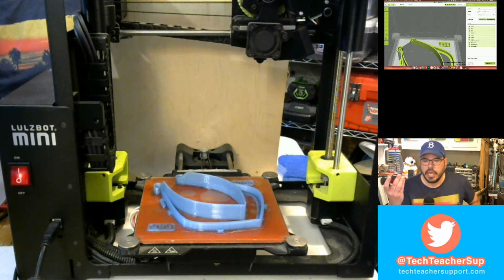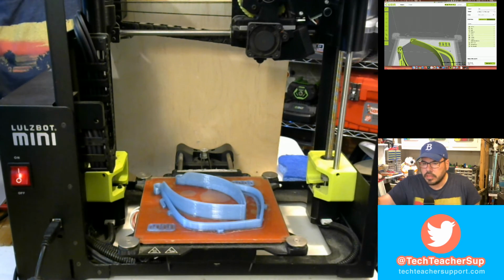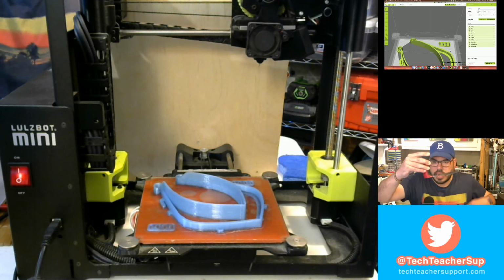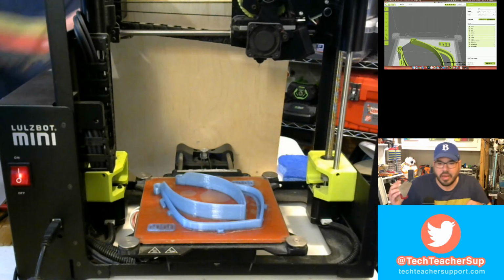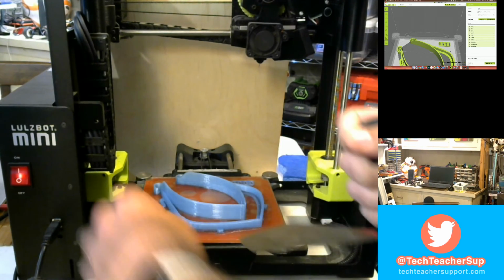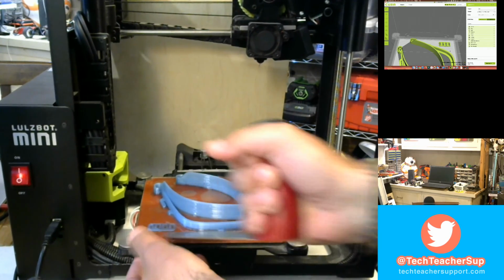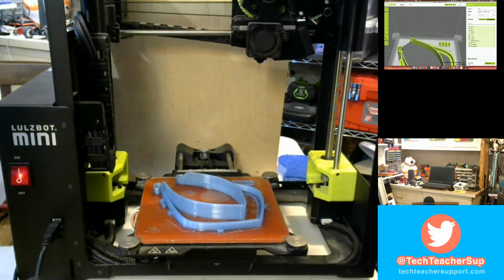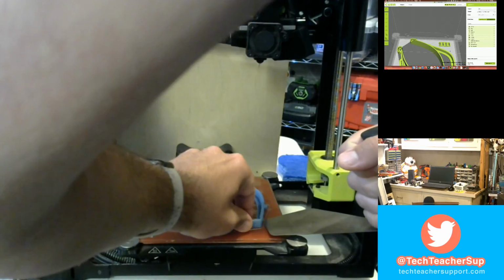And what I do with that is I use this paint scraper. I found it in an art store. It is really nice because it is flat, right? And it has a really sharp edge on here that you can kind of get under and scrape. So let's get these off this print bed so we can print again. And I'm just going to take this little guy here and just kind of try to get under those pieces. There's one. Oops. All right, we'll get that.